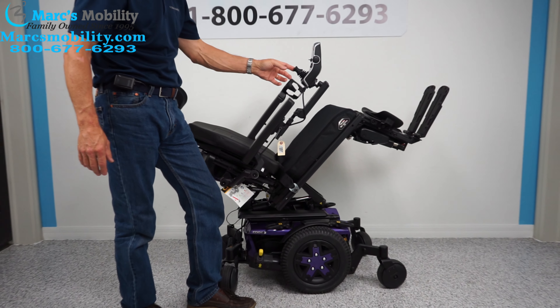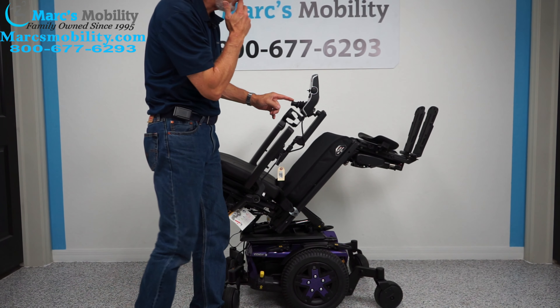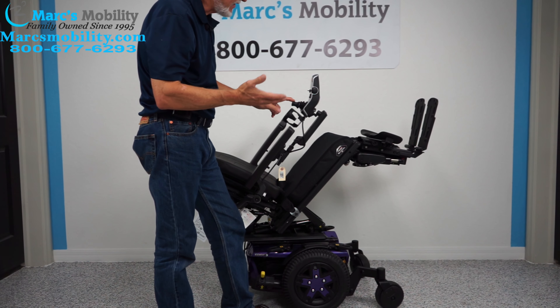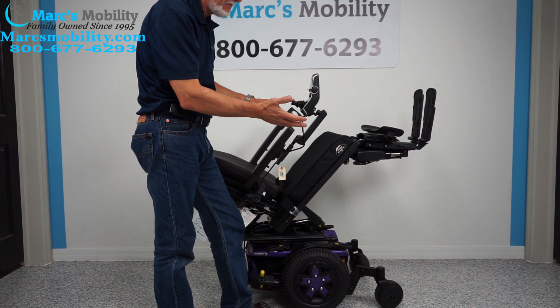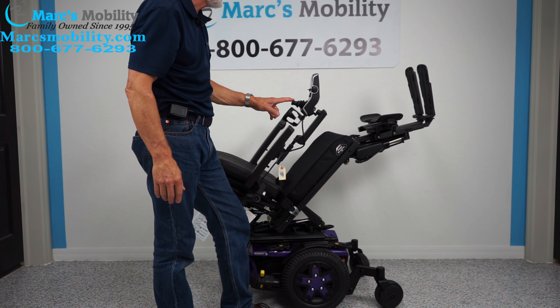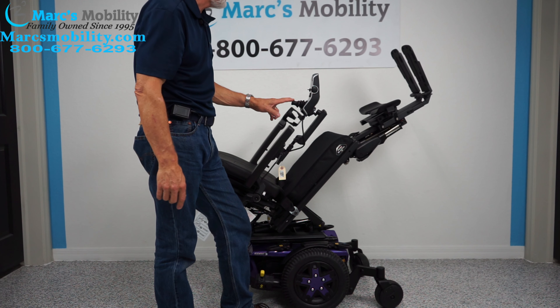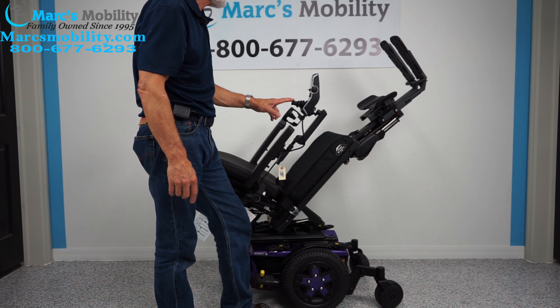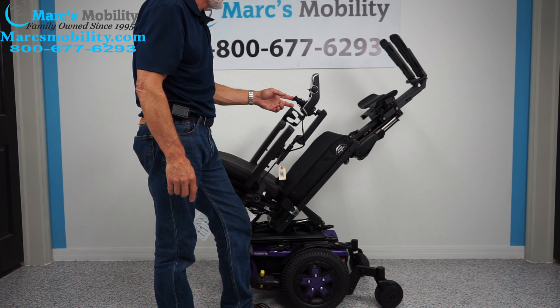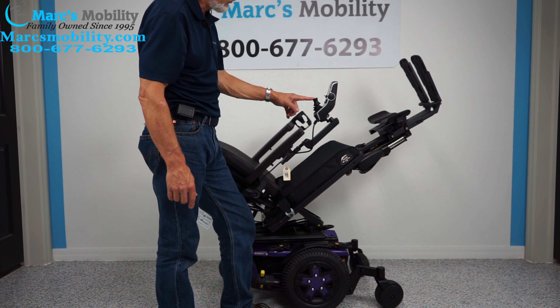The next function I'm going to do is the electric feet — we're going to get those up. If you needed some circulation, this might be a little extreme, but if you need it, you could get your legs way up there to the ceiling almost. This is one of the few chairs that does that. Now that might be a little extreme, so if you don't want to be this far up, you can be halfway down.